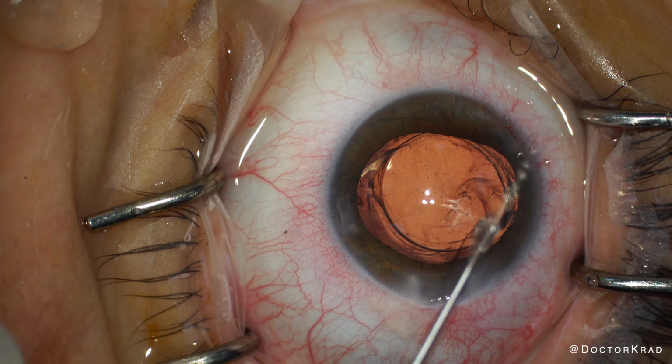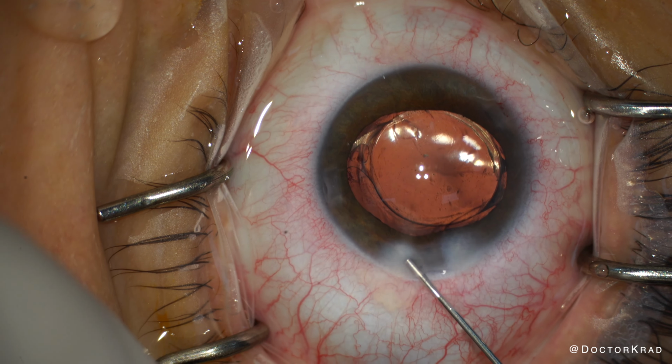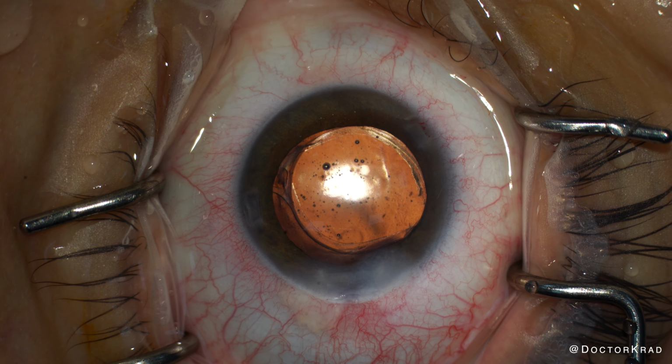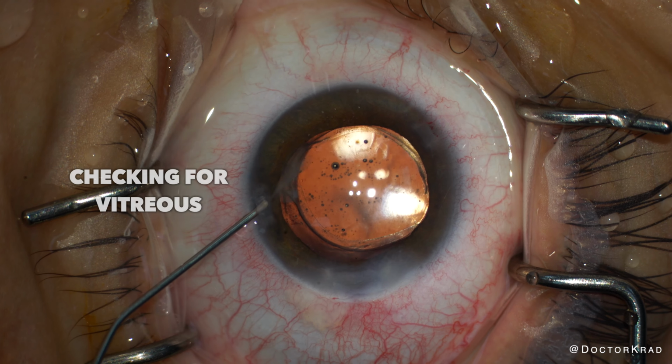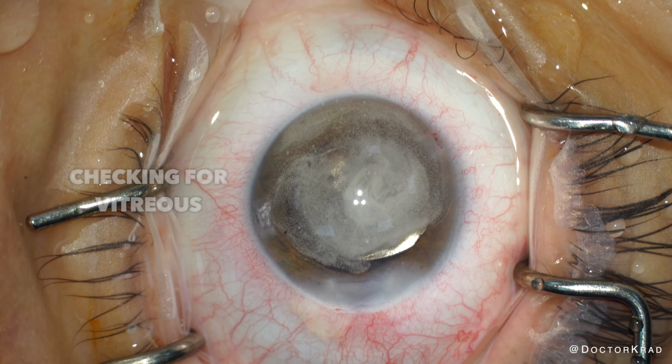If the patient ever had symptoms from the CTR, such as UGH syndrome, then a UBM or anterior segment ultrasound can be used to confirm its position. And in the unlikely scenario where it needs to be removed, perhaps an endoscope can be used to help visualize it. Next, I'm going to check for vitreous.